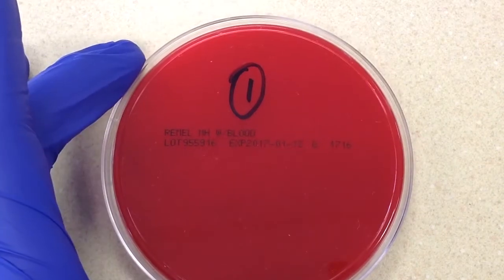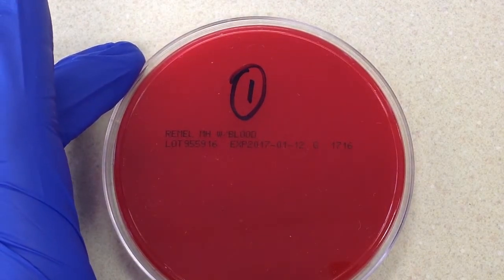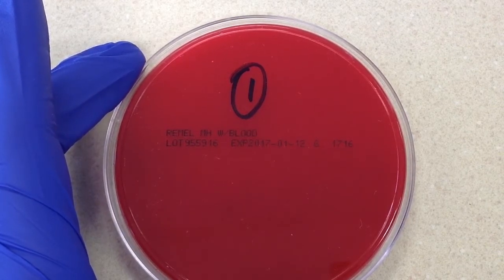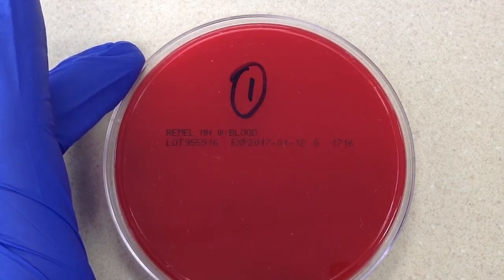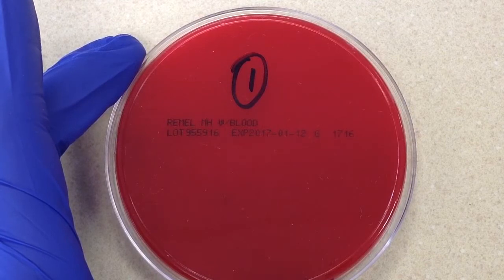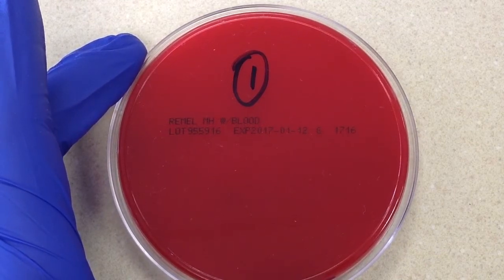This particular culture was set up yesterday, so it's incubated for 18 to 24 hours. Beta strep group A is one of those organisms that tends to grow better in a slightly anaerobic environment, meaning a higher percent of CO2. So this was incubated in a CO2 incubator.